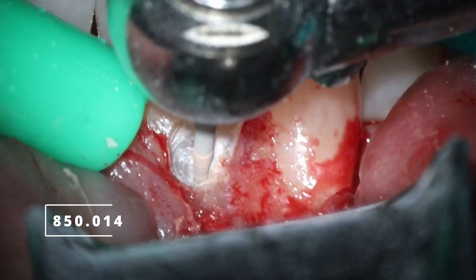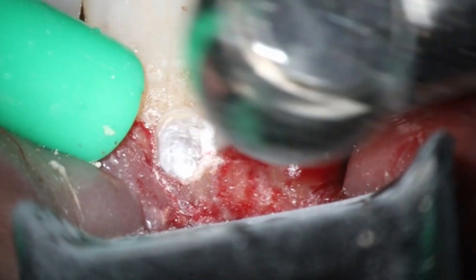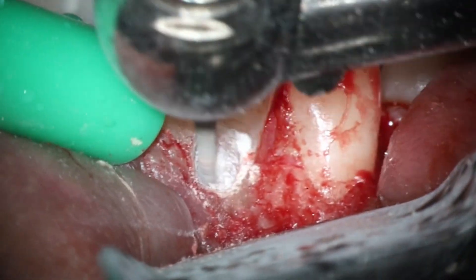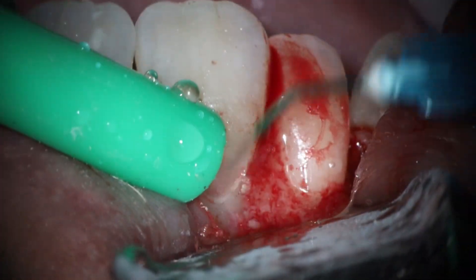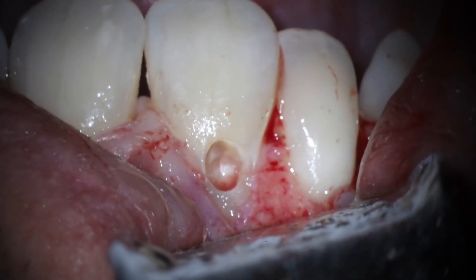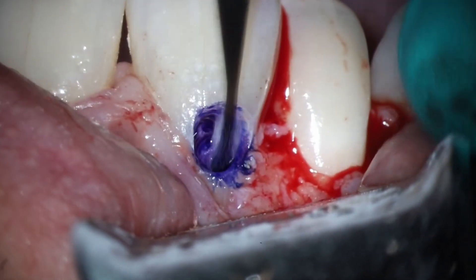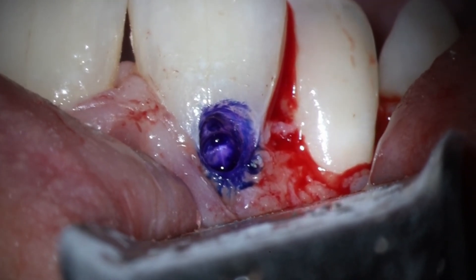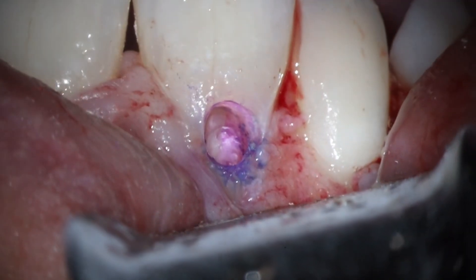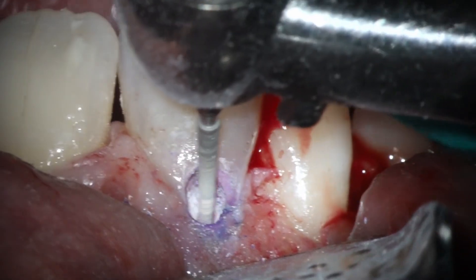When I took my calcium hydroxide shot a month ago, I was hoping we'd see a little bit more penetration into the actual area, but unfortunately no go there. Now I'm using that little skinny diamond to just start to get up into anything. What you can do is actually feel at this point where the soft area is, because the blood supply has gone in and created little tunnels — so it doesn't feel like you're prepping normal tooth structure. It actually feels soft, like it has holes in it like Swiss cheese, because that's what it does have. I found that this disclosing solution does a great job showing you the presence of the resorption. It's designed to show bacteria, but in this case it's able to show any of those little invasive areas where the blood supply got inside the tooth. I'll be going back and forth multiple times with it. You can see most of it there is at the apical portion — I'm going to be mostly focusing on that as we go through here.